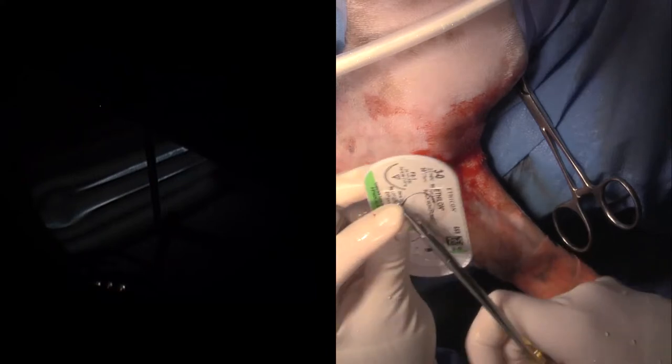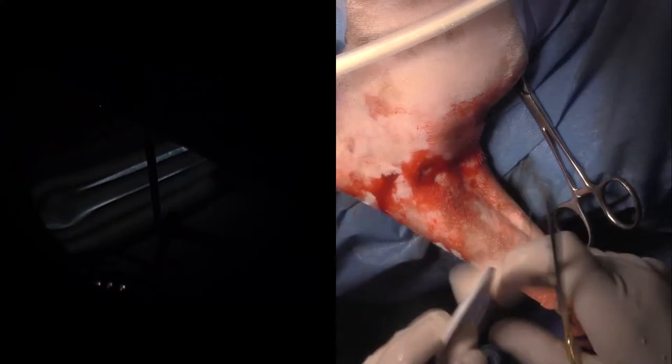So this is a 30-degree scope, 2.3 millimeter. The dog is about 10 years old. The bilateral elbow arthroscopy with CT scan is about $5,500 Australian dollars, which is about 4,000 US. There's no real limit on the size of dogs that can be scoped. It just is limited by the size of the equipment you have.